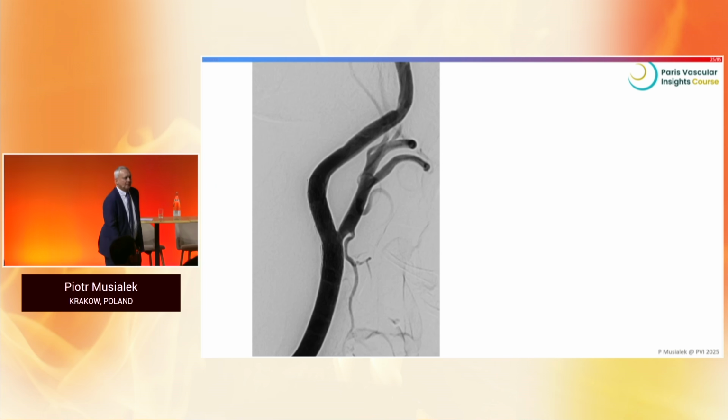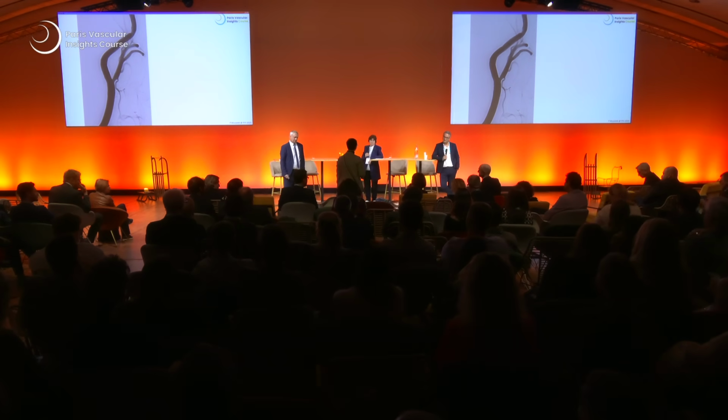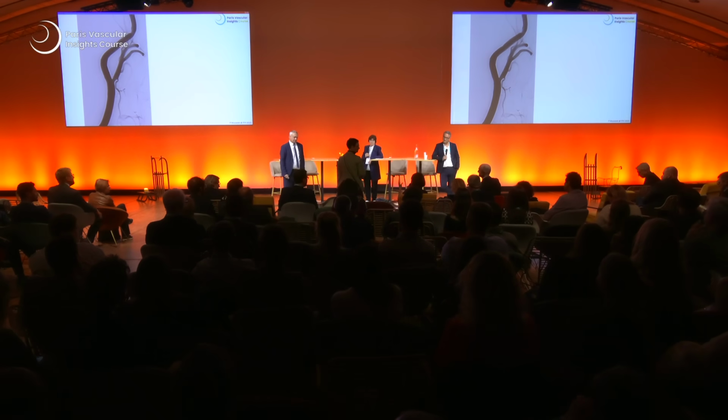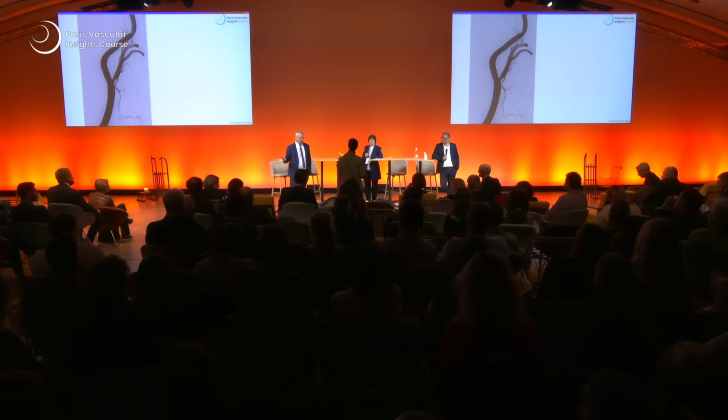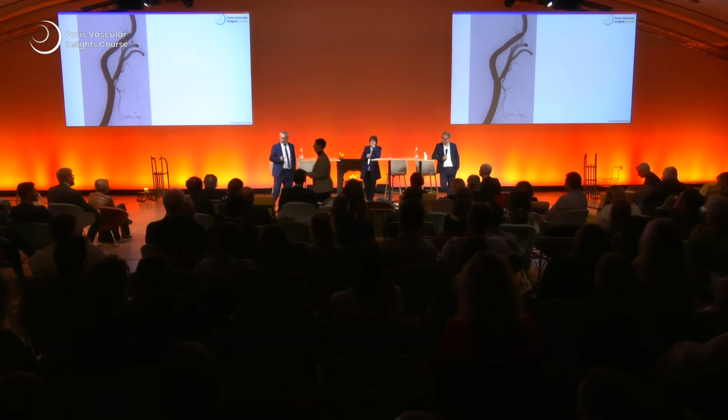Were you not concerned, irrespective of your protection devices, to predilate a 50% stenosis, if at all, from the angiography, a 50% symptomatic, high vulnerable plaque? What is the issue? The plaque was actually quite fibrotic, which I didn't say. I didn't say on imaging.